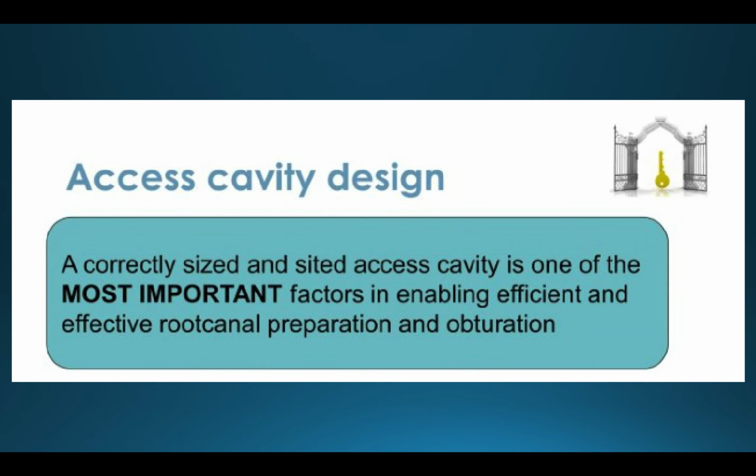If you start your access cavity preparation correctly, you will make the next steps of root canal treatment easier. And if something goes wrong during access cavity preparation, you will most likely end up with complications during root canal preparation and during root canal filling and obturation. So start your access cavity preparation correctly in order to end up with a successful root canal treatment.